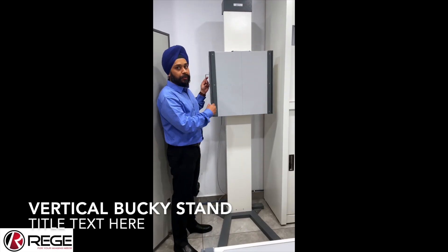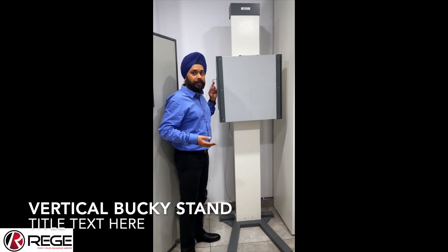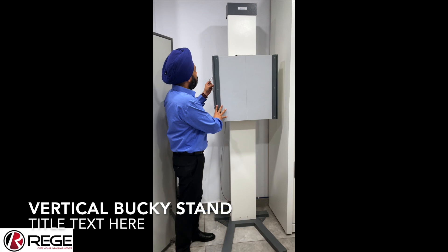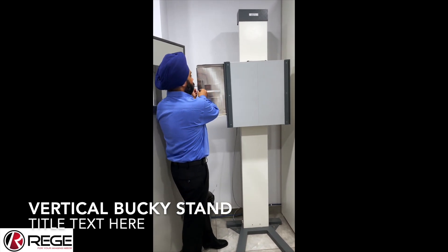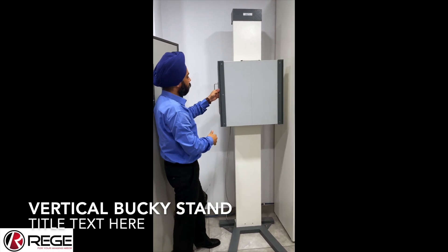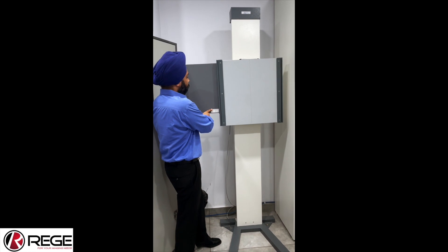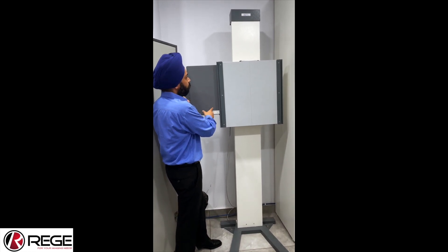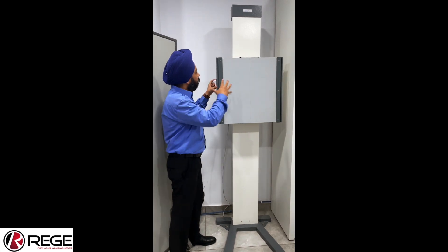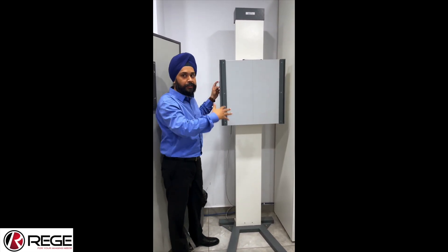Now I will show you the Epsilon vertical bucky system installed with our 32 kilowatt X-ray machine. This bucky has both a bucky system for scatter and a detector which can be changed. It also comes with an anti-scatter grid of 85 lines, which helps produce better image quality. The bucky grid is designed so that you can do all X-rays from chest to the knee.